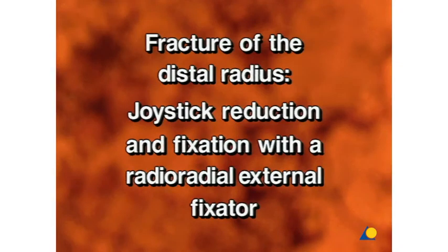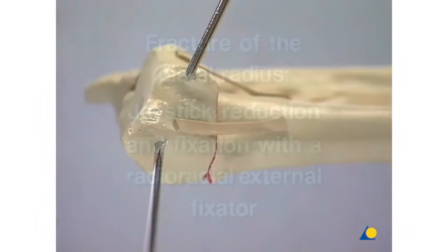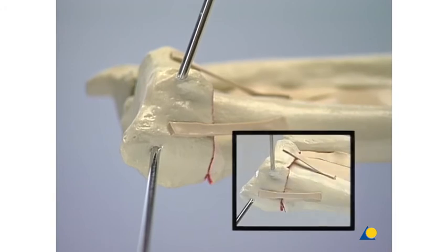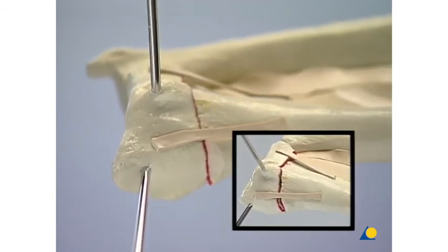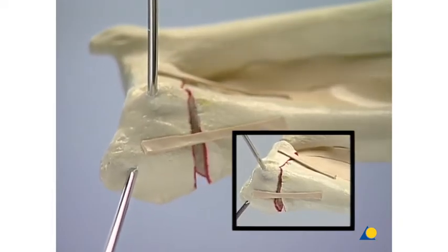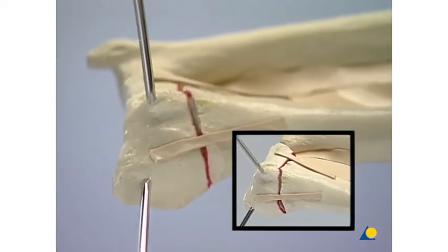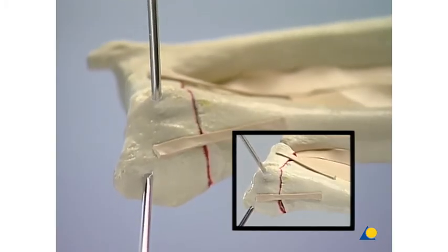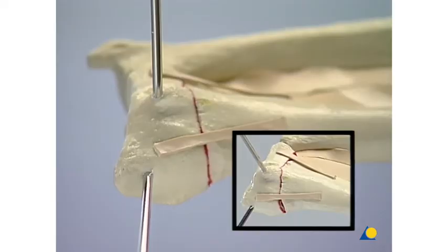Fracture of the distal radius, joystick reduction, and fixation with a radio-radial external fixator. A 2.5mm threaded K-wire is inserted into the tuberculum of Lister in the sagittal plane and a second K-wire is inserted into the styloid process of the radius in the frontal plane. The wires serve as joysticks for the reduction of the fracture in both main planes. The flexion-extension alignment and the correct radio-ulnar alignment of the fracture are easily attainable. After reduction, these two K-wires are combined with two additional threaded K-wires inserted into the proximal main fragment to form a radio-radial external fixator.